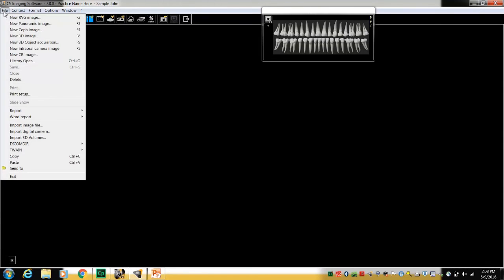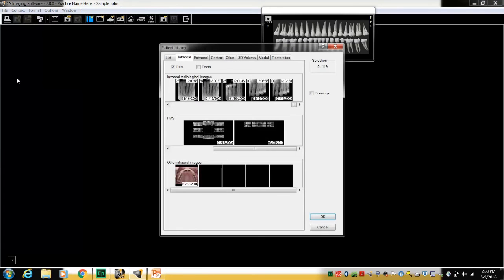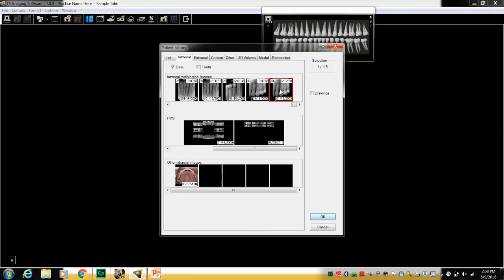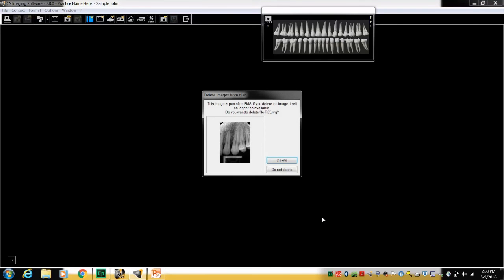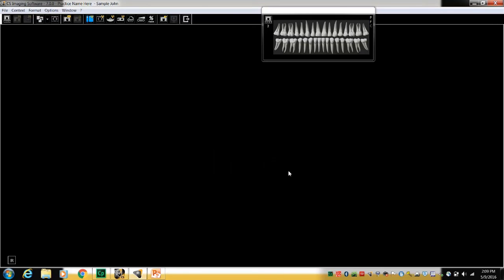File, delete. From the patient's history, select the image to be deleted. Notice the selection, instead of a green frame, has a red frame. And when you select OK, the system will prompt to confirm that you want to delete this image. You do have the option at that point, if it's warning that maybe it's part of a full mouth series, and that if you do delete it, you will no longer be able to see that image in the mount. So we're not going to delete that image. But if you said OK, you could delete that image from the patient's history.